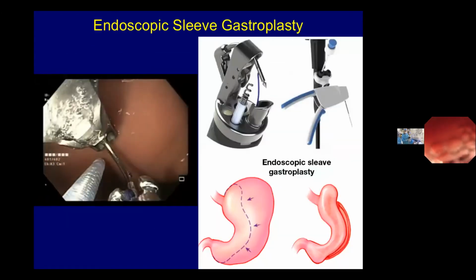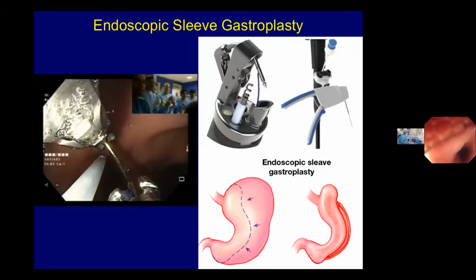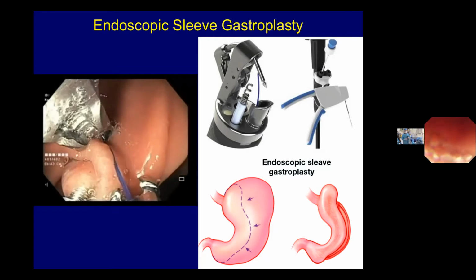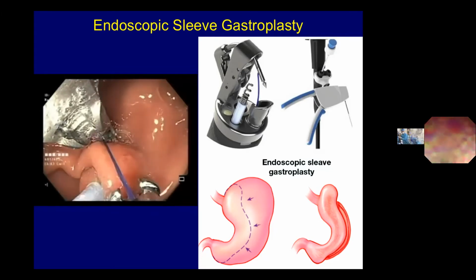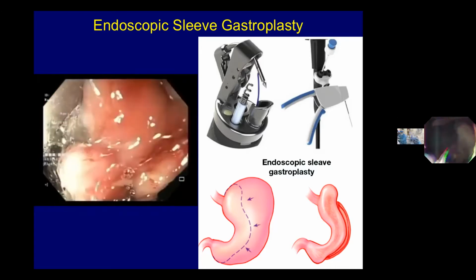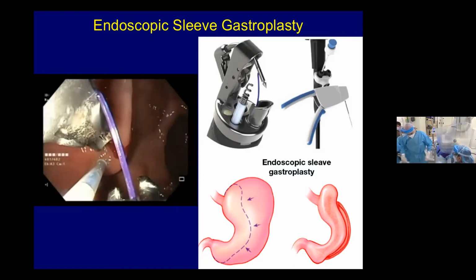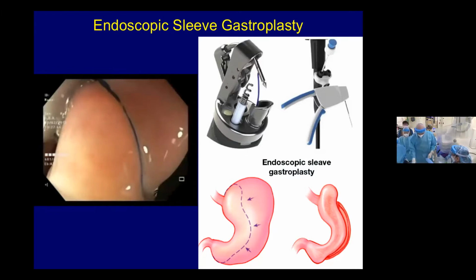Of course, bariatric surgery is a big new target for endoscopists. And I think, again, this is a future I see coming up very quickly. We are now doing a variety of endoscopic sleeve gastroplasty and other techniques. These are being modified. They are probably more physiological than laparoscopic sleeve gastrectomy. And again, comparative studies have shown that this is as good as laparoscopic sleeve gastrectomy. We're trying to see how this can be improved further, and certainly this will be done. So I think bariatric endotherapy is going to be the future, which is going to take over from laparoscopic therapies.